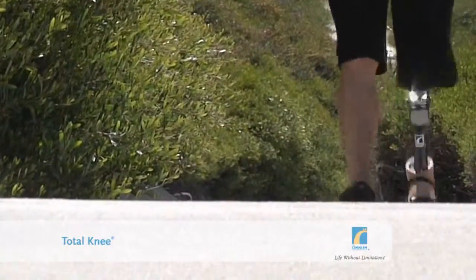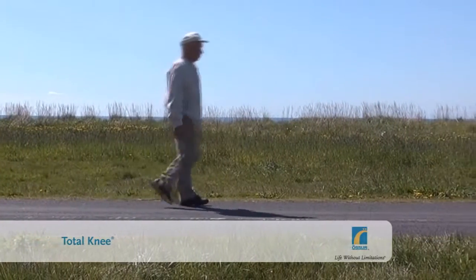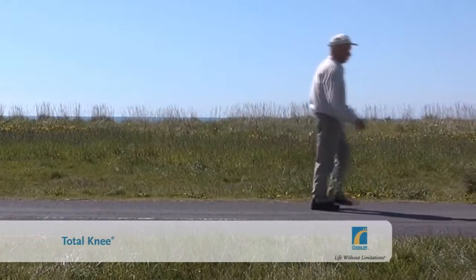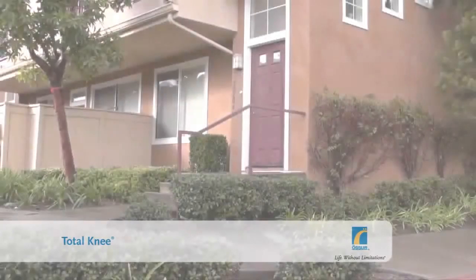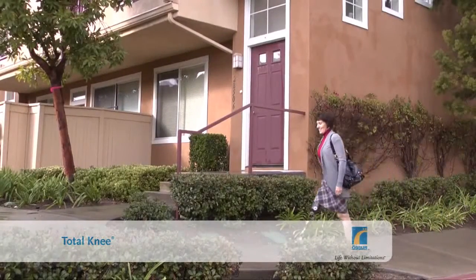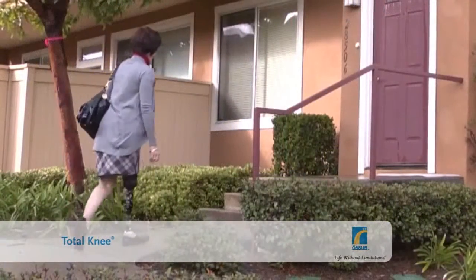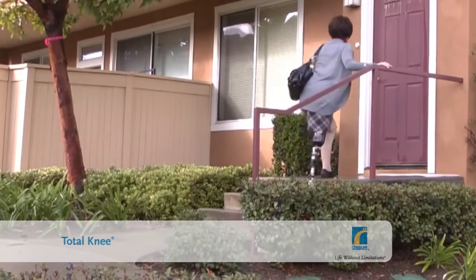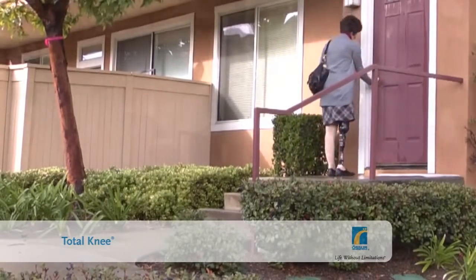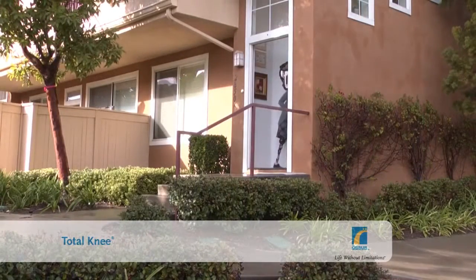Just as the leg starts to swing forward, the knee compacts, making the length shorter for a moment. The benefits of this increased space between your leg and the ground include a much more natural gait. There's no need to swing your foot out to the side in order to clear the ground, what's often called hip hiking. The added safety factor is that you're far less likely to catch your toe and take a stumble as a result.